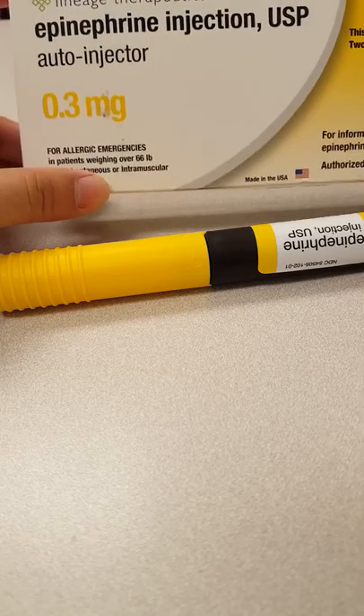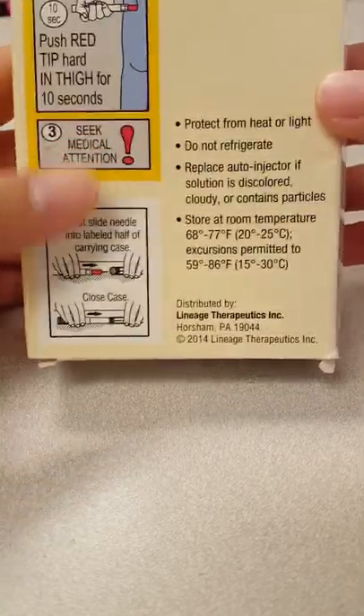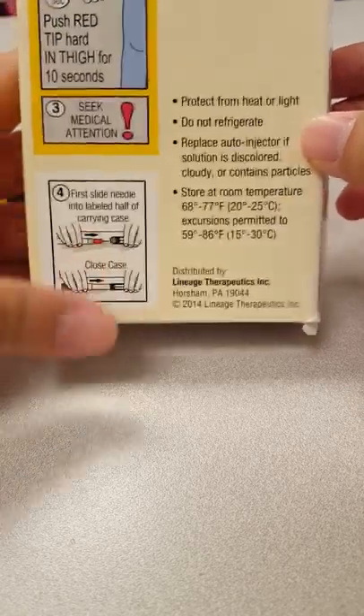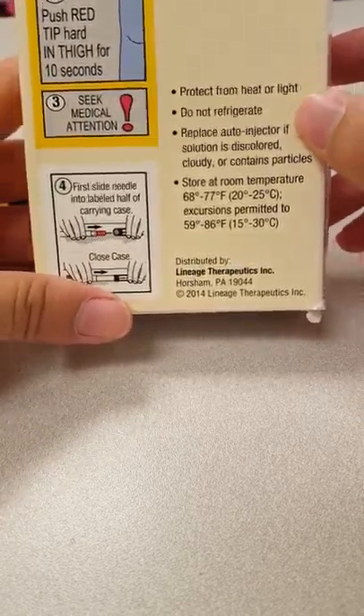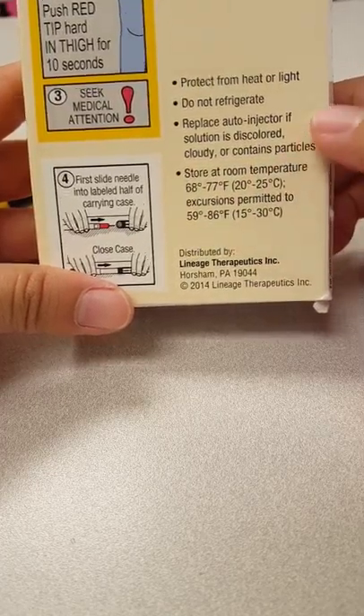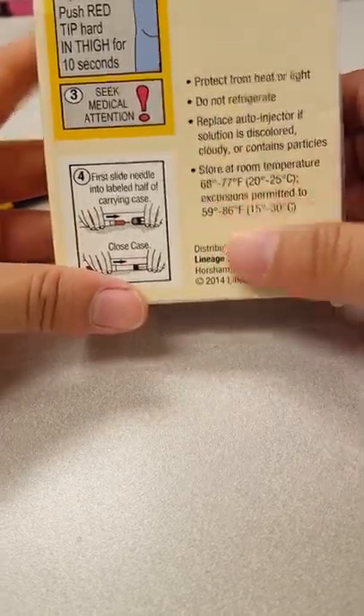This is for patients weighing over 66 pounds. A few quick instructions: protect it from heat and light, do not refrigerate it. Replace it if you see that the solution is discolored, cloudy, or contains particles. Store it at room temperature, 68 to 77 degrees Fahrenheit.